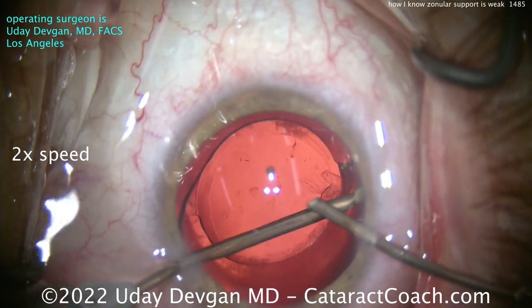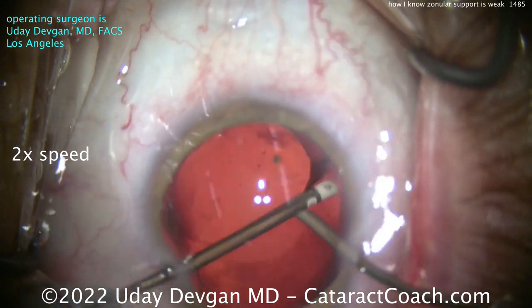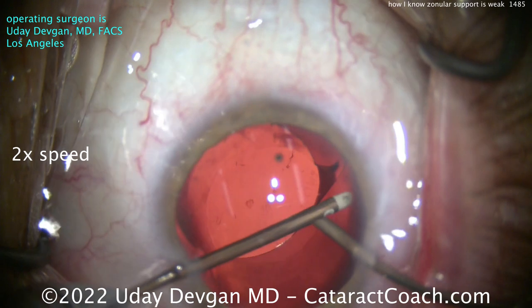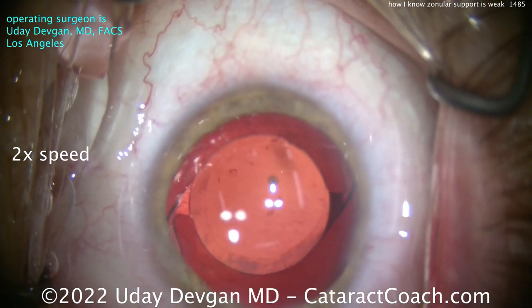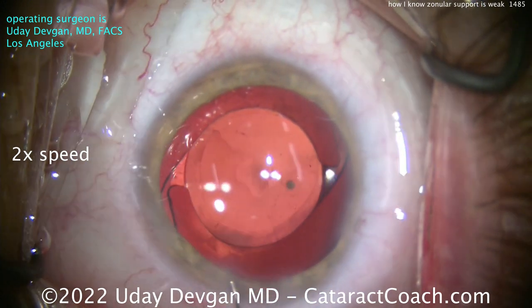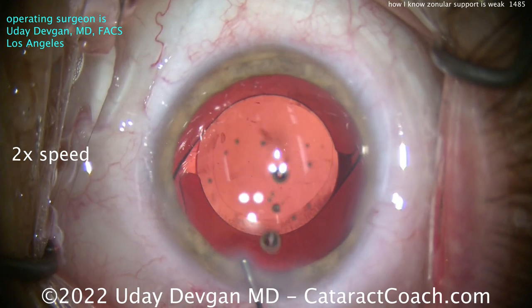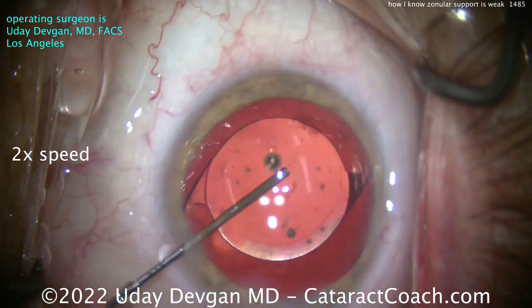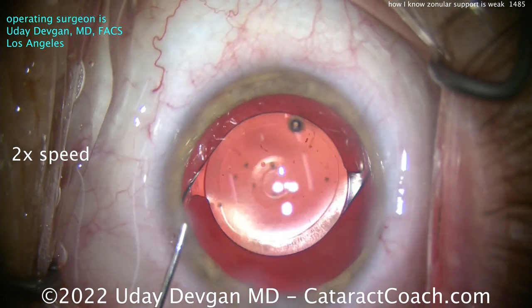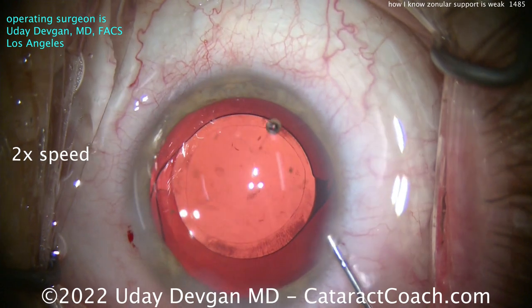We've cleaned it up pretty well now. Lucky this is not a toric lens, so it doesn't have to be oriented in one particular meridian. We're able to really clean up that cortex pretty nicely. Now let's seal this up at the end and make sure everything is good to go. We may want to put some triamcinolone on the side just to confirm there's no vitreous prolapse — I'm pretty sure there isn't, but we can always check.